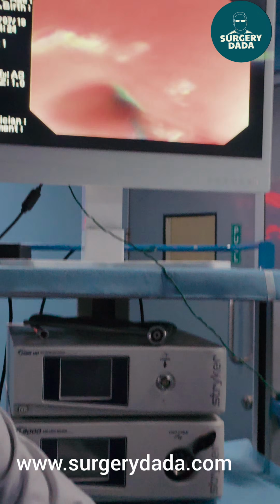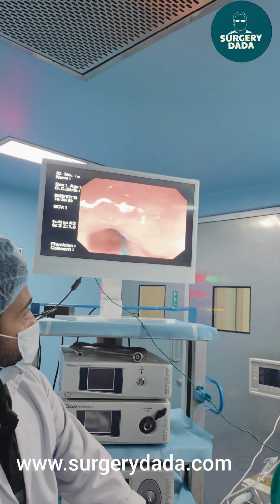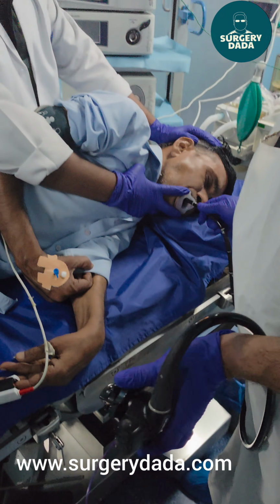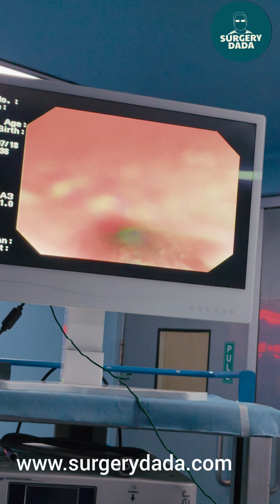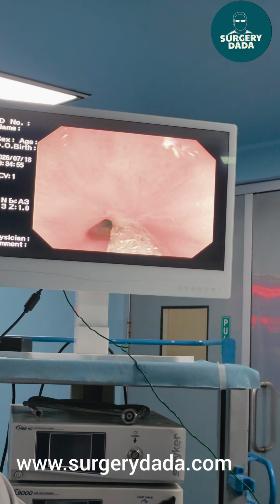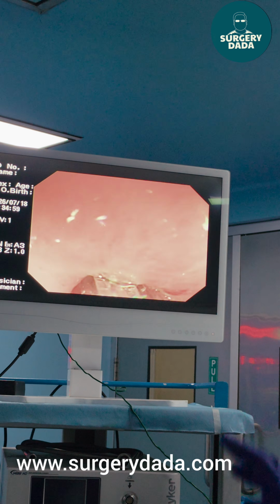Now this is the guide wire. We are doing a balloon dilatation for this patient. So how a balloon dilatation is done, just show this. Via this channel we have put the balloon, and now the balloon is taken inside. Pause. Balloon has gone, and now we are going to insufflate the balloon. Insufflate it. So we are basically doing a dilatation.